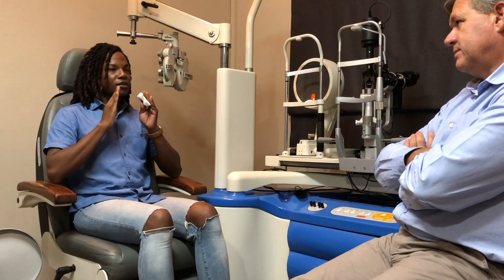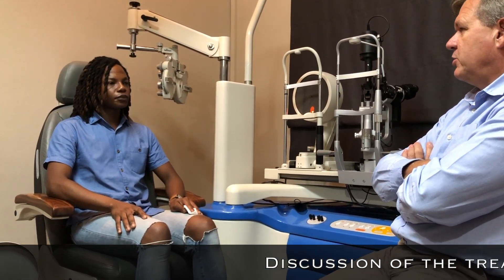If you feel them a little bit, that's normal. This will take about a week to two weeks to get used to, but you will not believe how well you see with these lenses. For this kind of situation, it's the healthiest as well as the most cost-effective option. These lenses can last from two to four years depending on how you look after them.